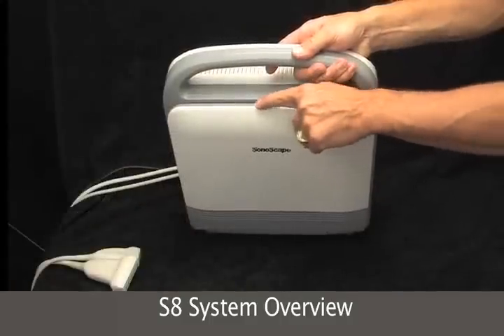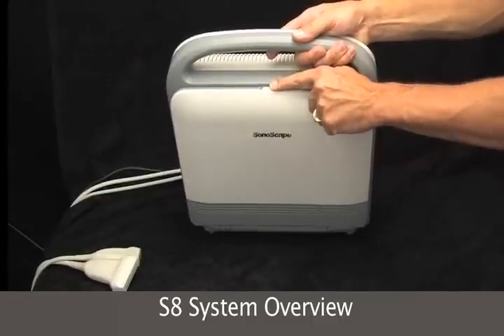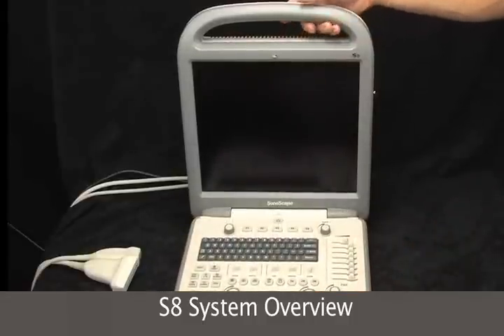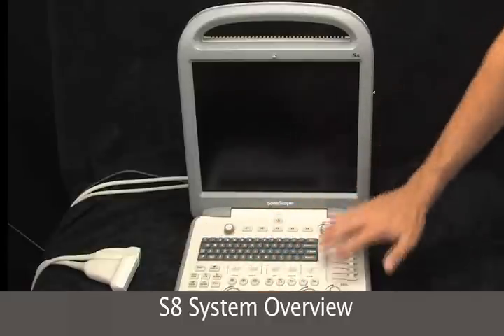Here's the latch. Just pull it aside and then you can open it right up, and we have the flat panel monitor and the keyboard.